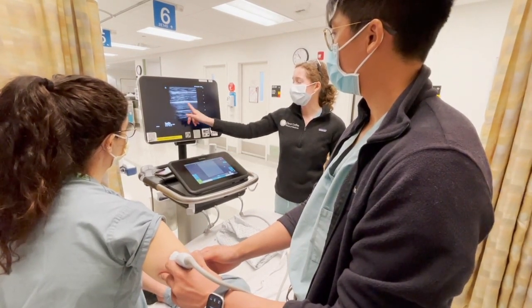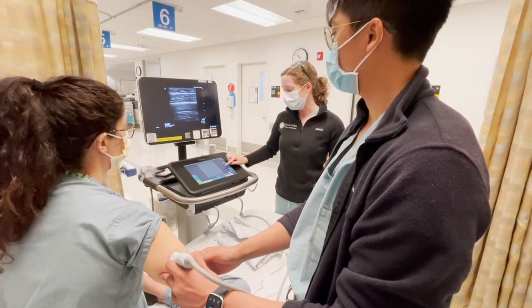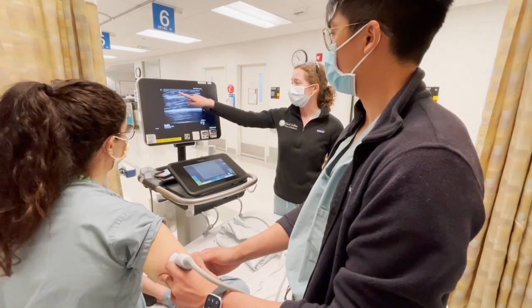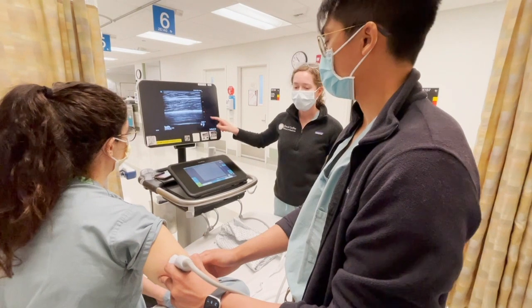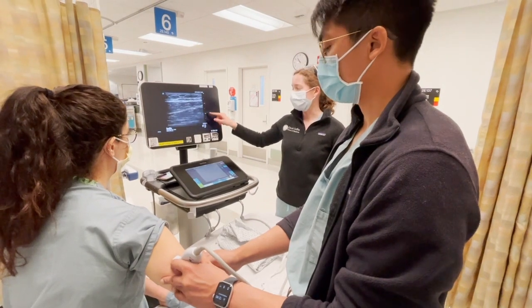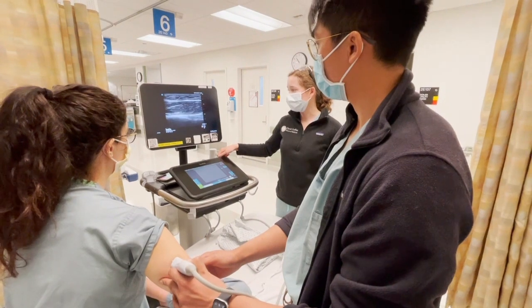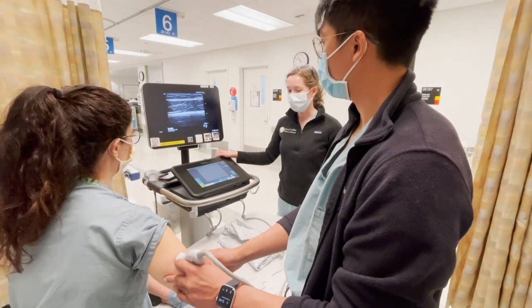If your depth is too increased, you'll actually see an artifact where the muscle is reflected underneath or in the bone, so you'll want to decrease the depth so you've got a window showing the subcutaneous tissue, the muscle, and then the bone. If you fan the probe, you can see the anisotropy of the bone — it comes out of focus and gets fuzzy, then goes back into focus as a sharp line when you're perpendicular.